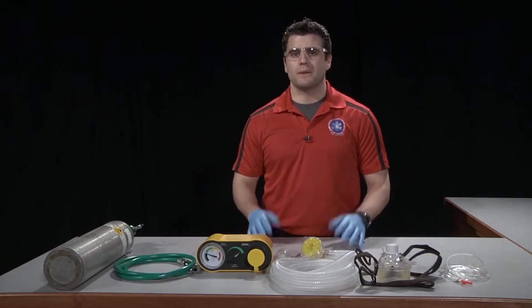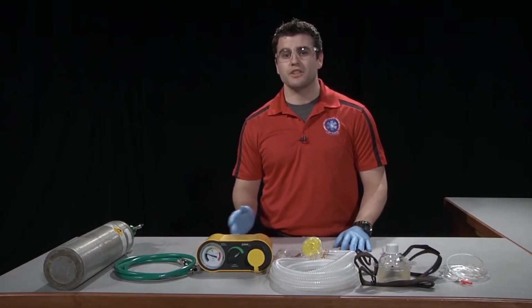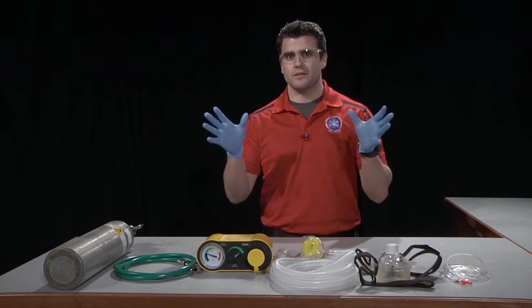Our first step is going to be to take our standard precautions. For this skill, we'll need eye protection and gloves. From there, we want to ensure our patient has an adequate blood pressure. We also want to then sit them in a high Fowler's position to ensure ease of ventilations.